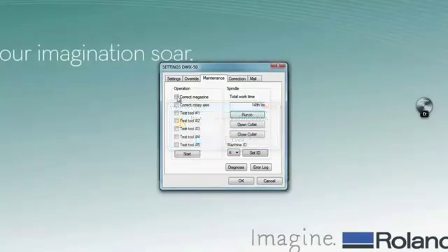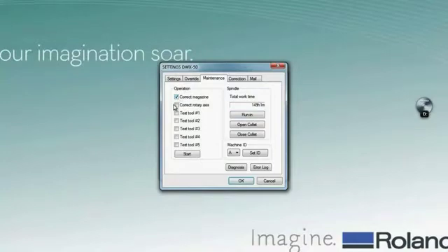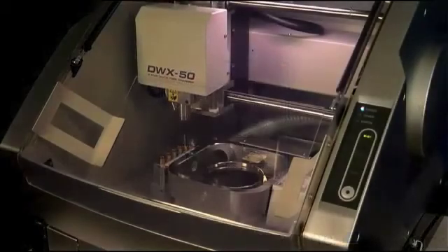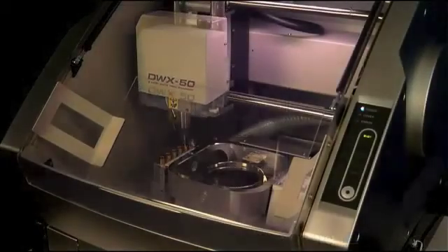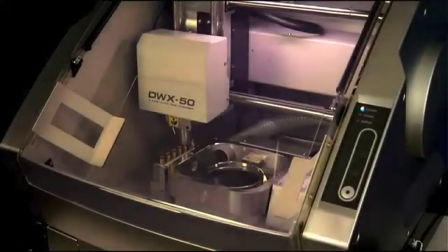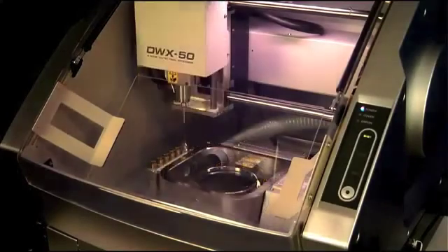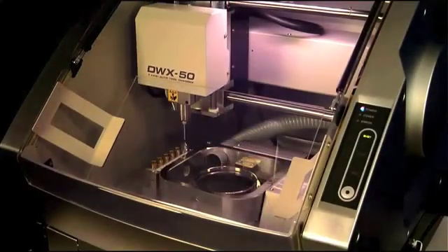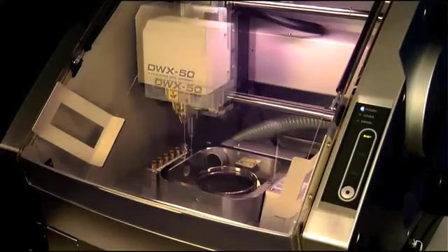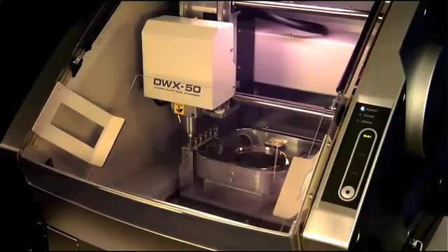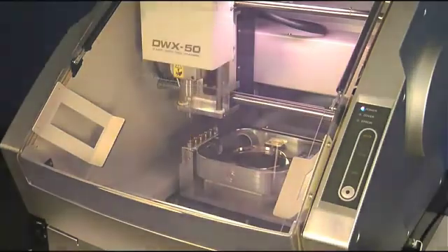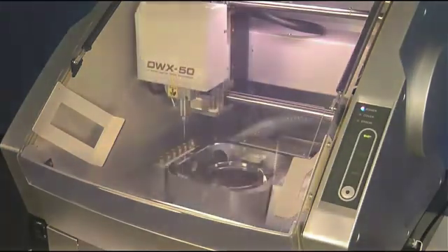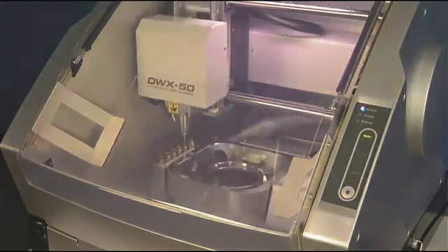After completing the run-in process, you are now ready to calibrate your machine. To do this, click on the correct magazine and correct rotary axis button, and then click start. During this process, the spindle will pick up the calibration pin out of the tool holder and make several measurements throughout the fixture, and then replace the pin once it is finished calibrating.